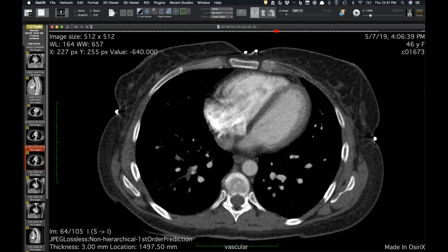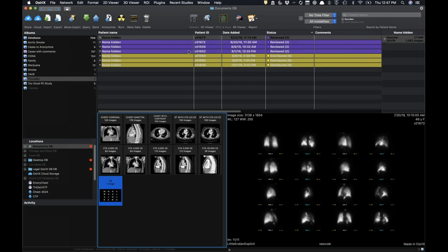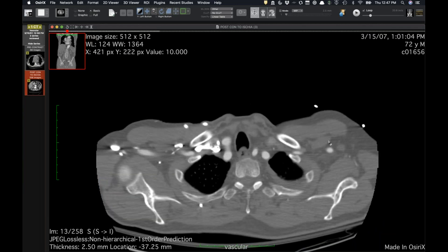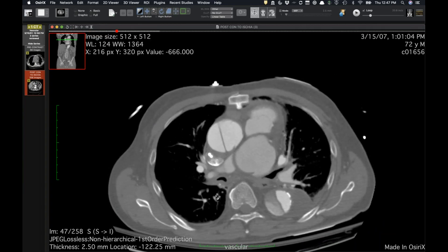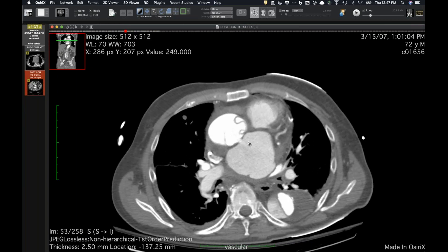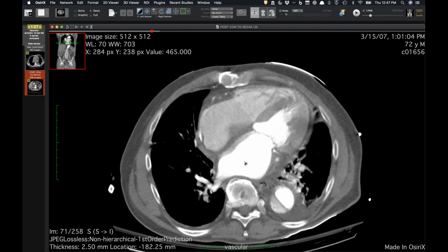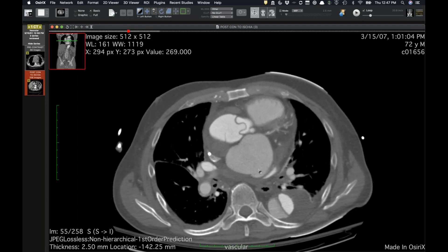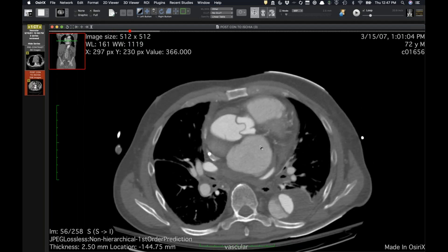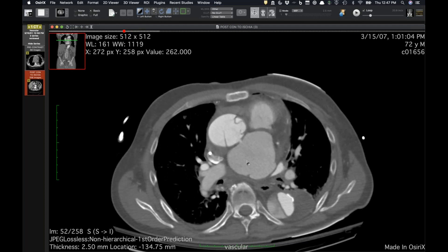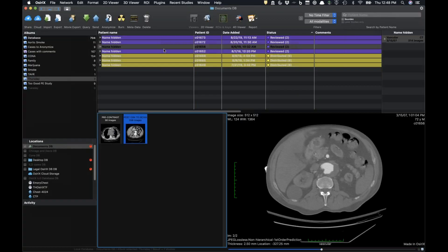That one went to the top of the list when I saw it this morning. This is a relatively well-known old case from over a decade ago. This is a patient with a type A dissection. The story is you can see the left atrium, and this was reviewed several times — originally it was thought this structure was the left atrium, but this is actually the left atrium. So this is like a double left atrium sign from a big pseudoaneurysm collecting in the mediastinum and exerting mass effect on the pulmonary arteries. We've seen this sometimes postoperatively when you get dehiscence from a valve, especially along the mitral-aortic intervalvular fibrosa, where something collects between the left atrium and the vessels.